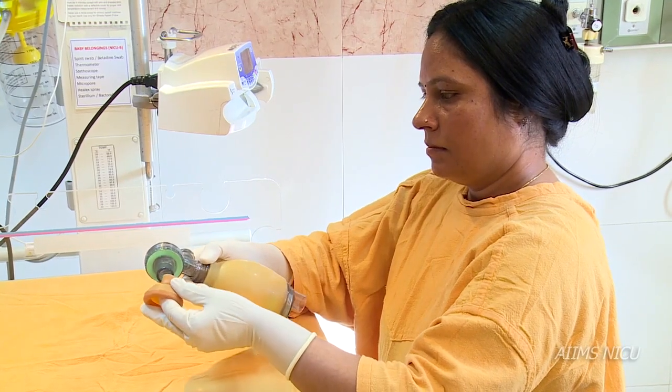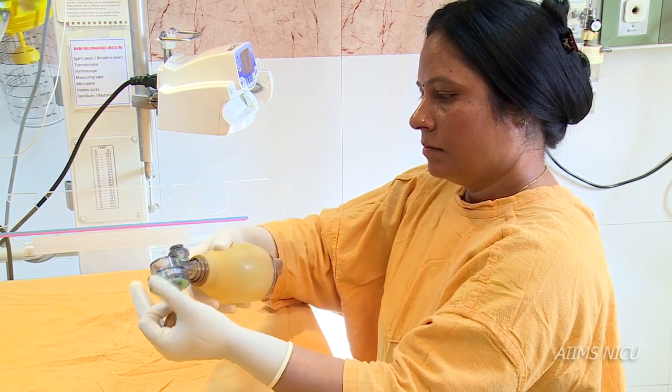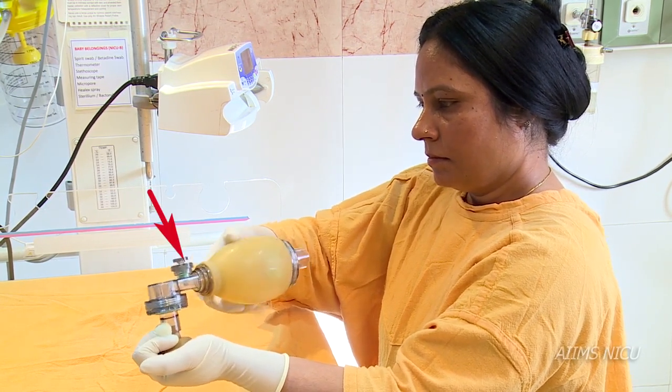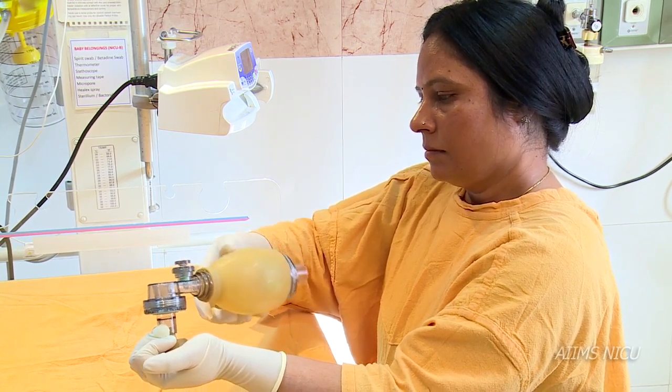To use a self-inflating bag, press the face mask firmly against the palm and squeeze the bag. Feel for the pressure in the hand. Also, see the up-down movement of the pop-off valve — the bag should re-inflate immediately after use.